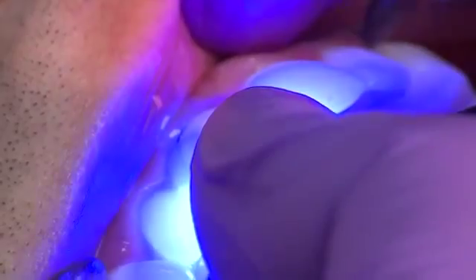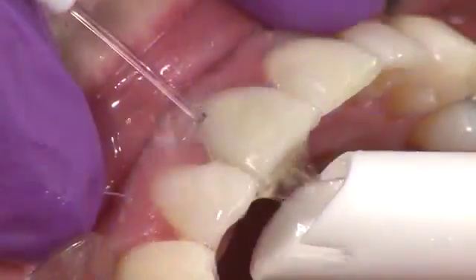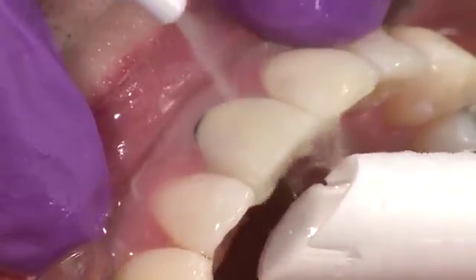Keep in mind, the curing light will not penetrate through opaceous or metal crowns. In these cases, Permaflow DC will chemically cure in 5 to 8 minutes.